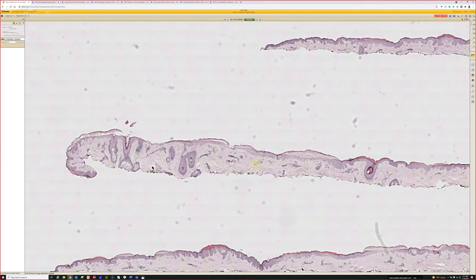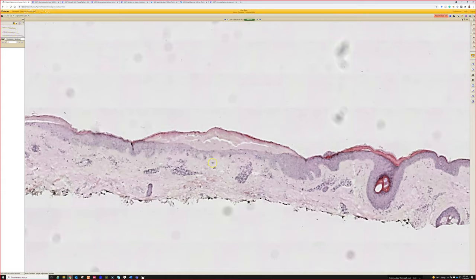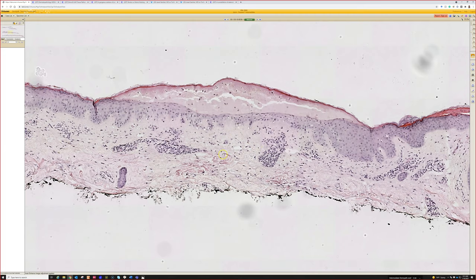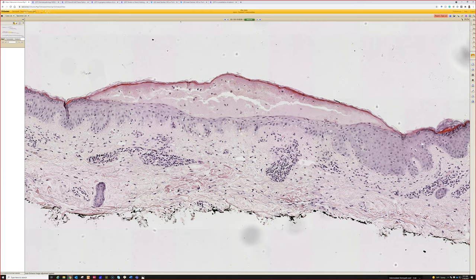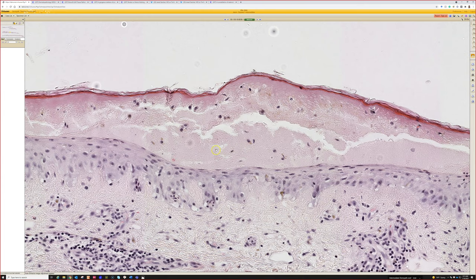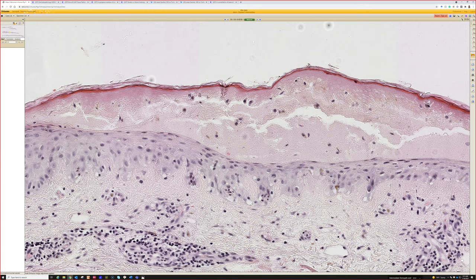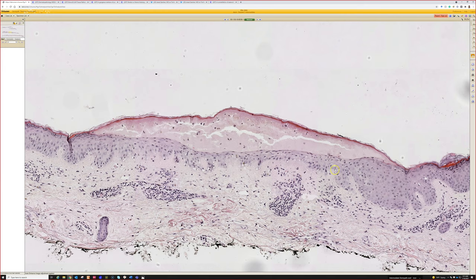Case ten, we've got a shave. It looks like the very superficial epidermis is pink — it's dead, necrotic. And then there's some serous fluid coming in between that space. This is something acute that happened, and it's probably something external, just given that the deeper epidermis looks entirely untouched from that process.